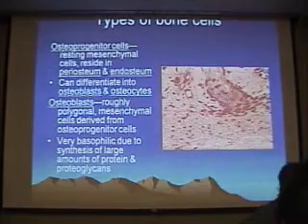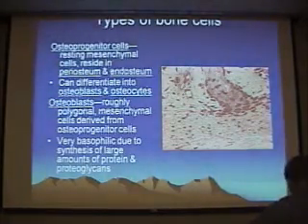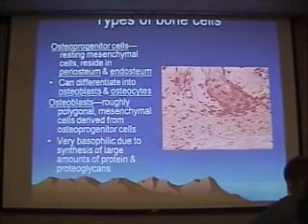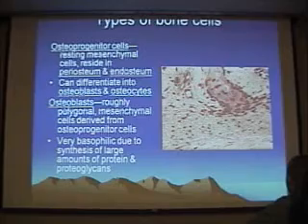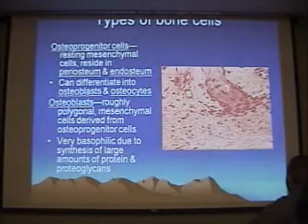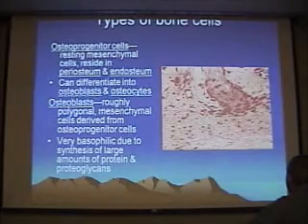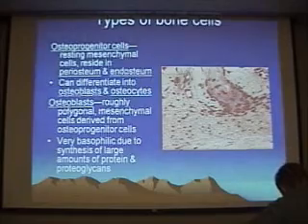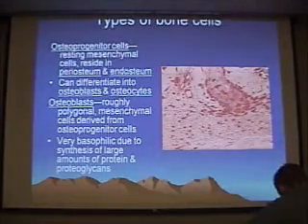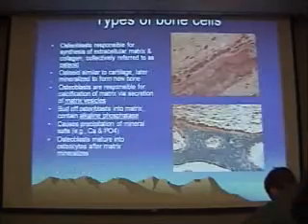When it comes to types of cells within bone, we have primitive osteoprogenitor cells, which can be a little difficult to distinguish individually. Basically, they're just big, darkly staining cells. What you should be able to recognize are the osteoblasts. These are the osteoprogenitor cells which have undergone some differentiation. They're beginning to produce extracellular matrix. And these osteoblasts are often found around forming spicules of bone.